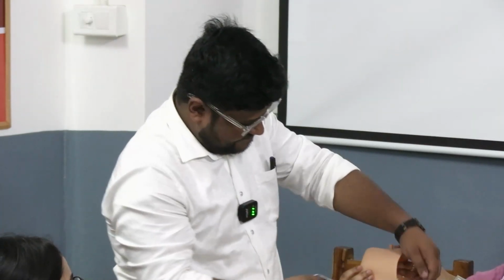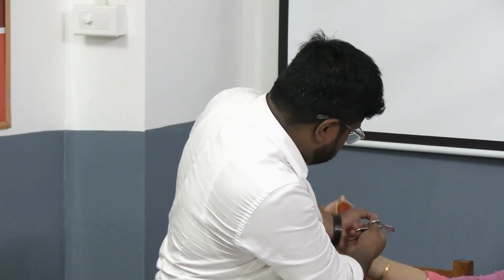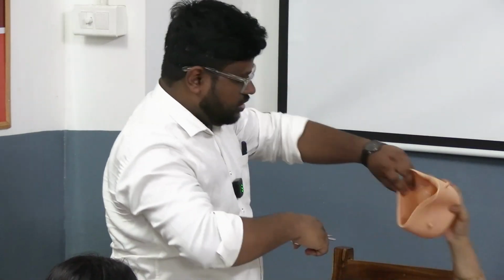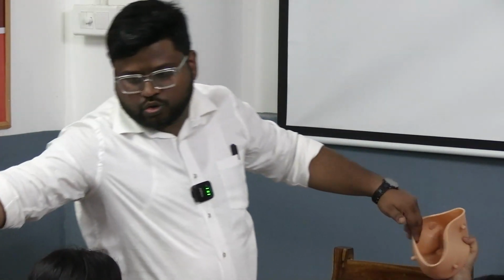দেখো এটা এখান দিয়ে রাখো। আমি পিছনে আছি না, this becomes difficult for you to understand. এই আঙ্গুল, এই সিম্পল মুভমেন্ট হাত। আবার ওদিকেটা দেখো। আমাকে ওদিকে যেতে হবে। I am standing here. Why is it difficult? তোমার এতগুলো মুভমেন্ট আছে হাতের, সুপাইনেশন আছে, প্রোনেশন আছে, কেন হচ্ছে না? দুটো রিং দেখো, same side facing and finger grips are facing the same side because the support is needed. দেখো দুটো, one will be like this, one will be like this.